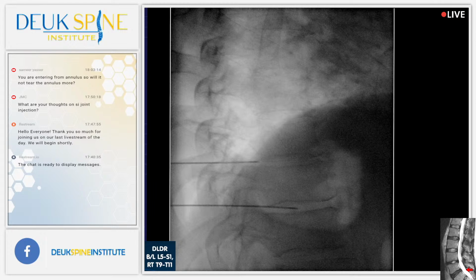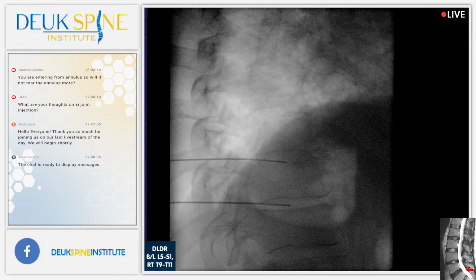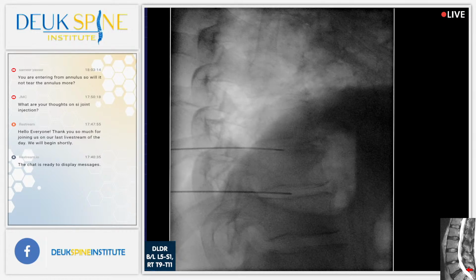I just turn everything off. Yeah. All right. Shot? This is 9-10. I wanted him a little more relaxed while you're doing this. No, you did the right thing. We're in. So we're in 9-10. We're in 10-11. Let's verify that we're in the right levels. One more shot. Let's get an AP.